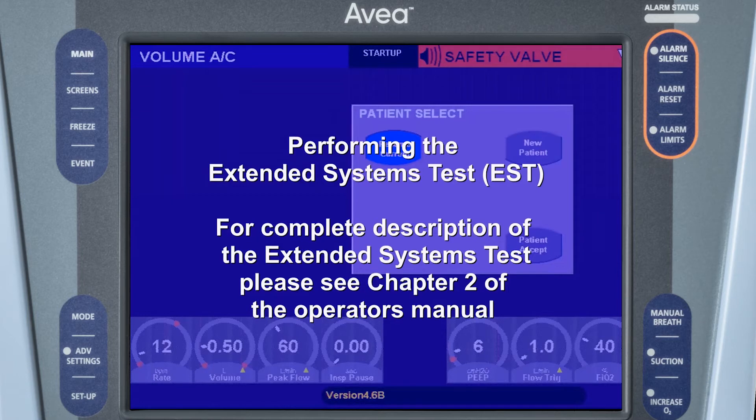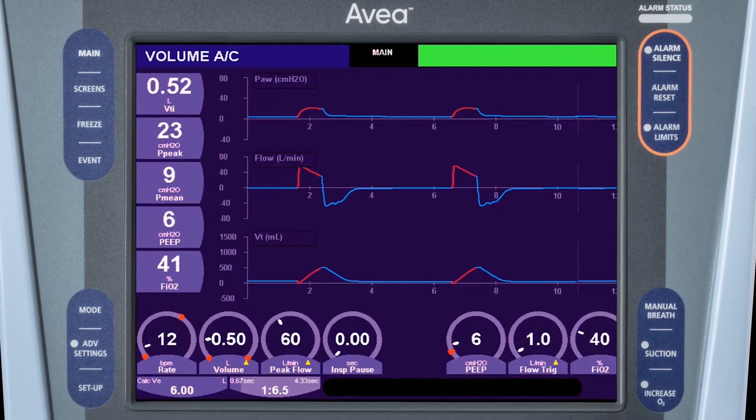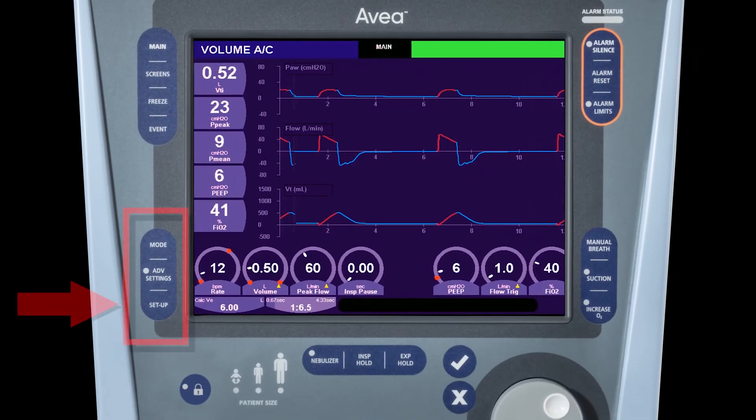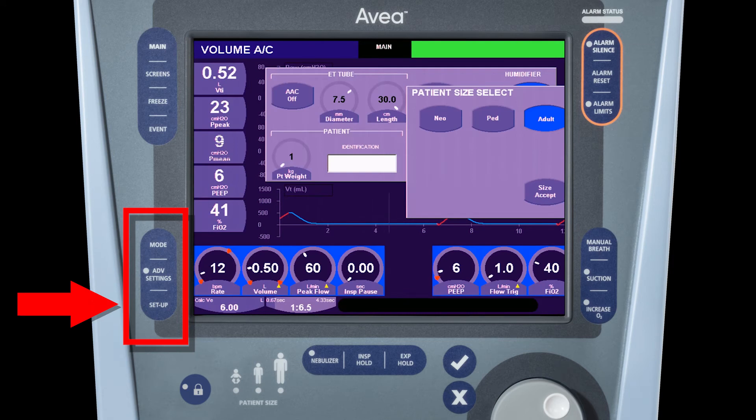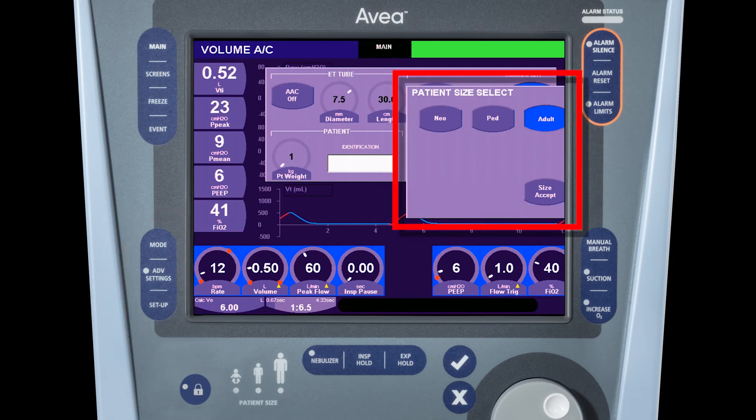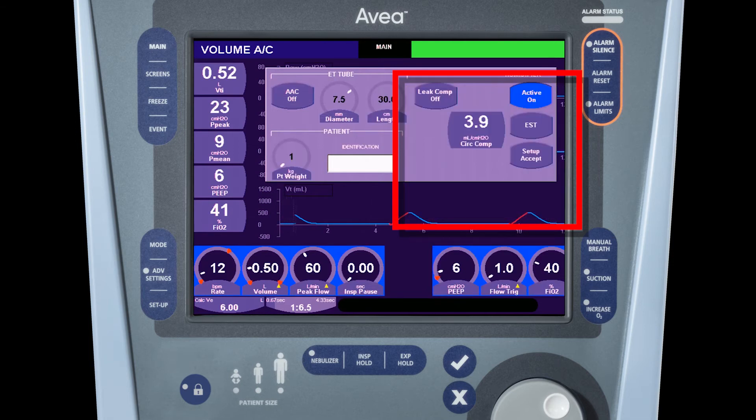Now we're ready to perform the extended systems test. For a complete description of the extended systems test, please see chapter 2 of the operator's manual. To access the setup menu, press the setup button on the front panel of the ventilator. This menu is also opened automatically when the ventilator is initially powered on. Choose the appropriate patient size and press size accept. You'll notice the EST button on the right-hand border of the display.